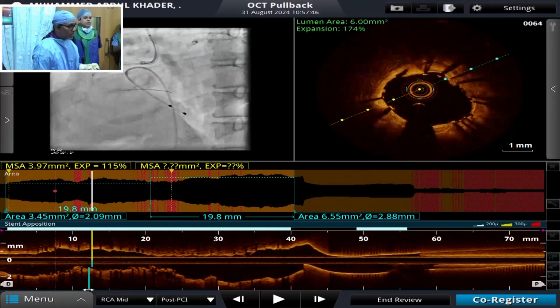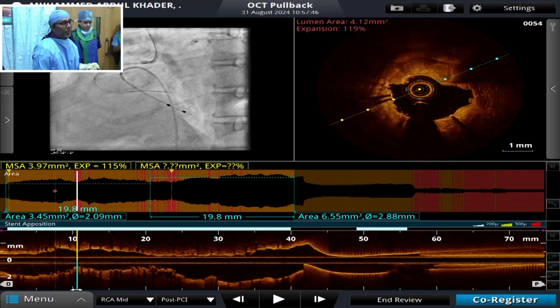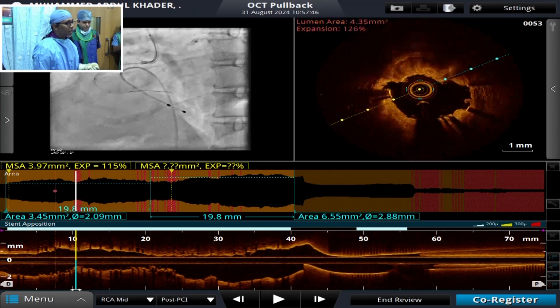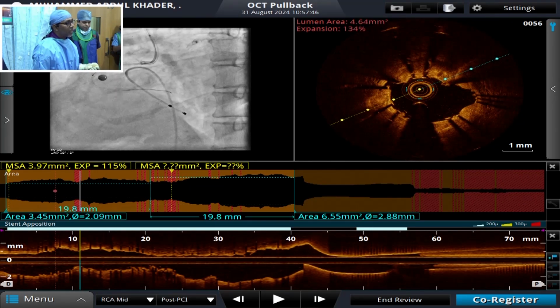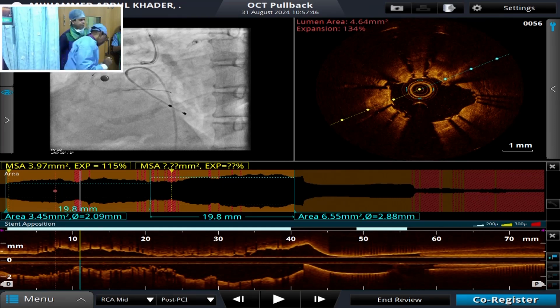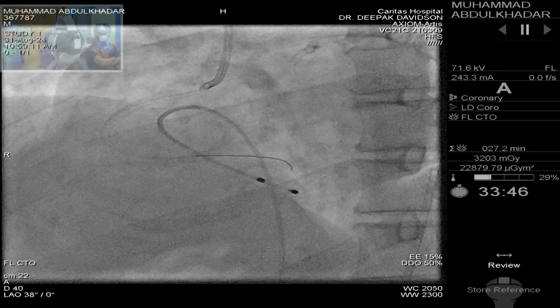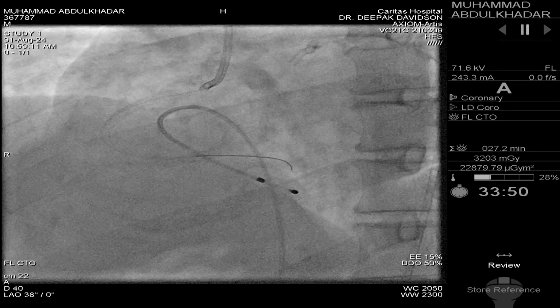So we just go in this particular area alone with a 3 millimeter balloon, go at 22, 24 and then stop. This particular area, we can see the angio co-registration, the area where we had just a 3 millimeter balloon at high pressures, and stop. Final shoot, nitro shoot. I think we'll do a balloon dilatation and then do a final shoot.